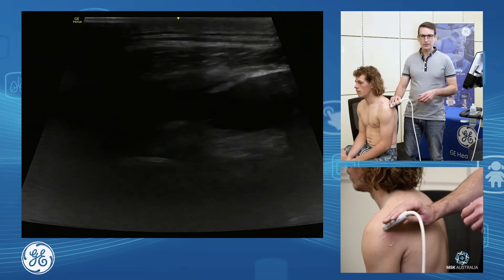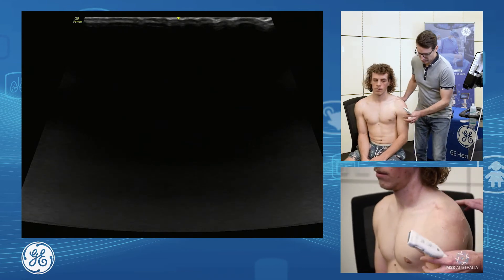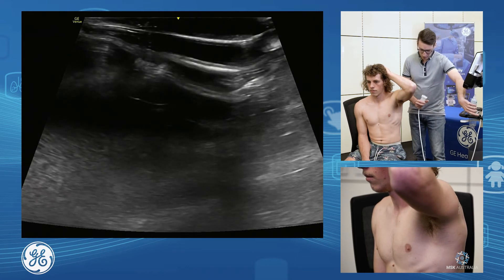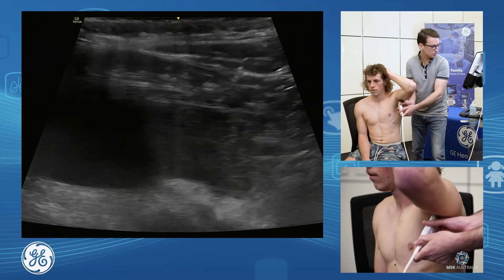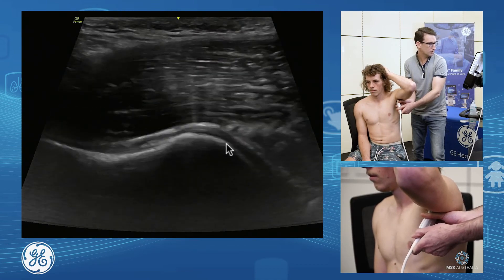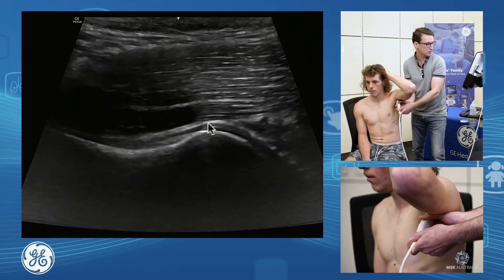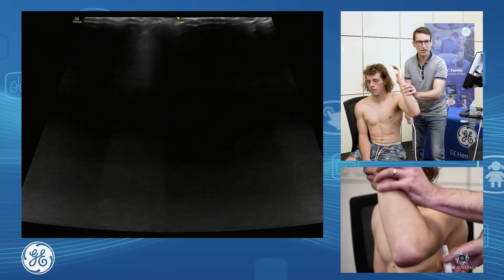Once we've assessed the back of the joint, we also want to assess our inferior joint capsule. We'll slide our patient around and get the patient's hand on their head in a nice relaxed position, then add extra gel to the probe. All I do is eyeball the line of the humerus, put my probe under the arm, and scan back and forth to find the humeral head and line up. Scanning through the entirety, we want to see that capsule coming over the articular cartilage and down through into the neck. That's a simple way of looking at our inferior joint capsule.